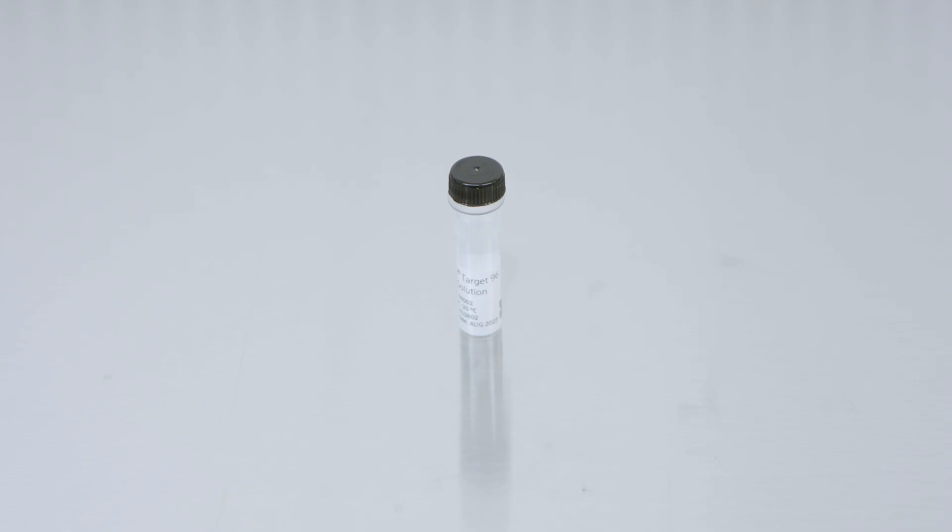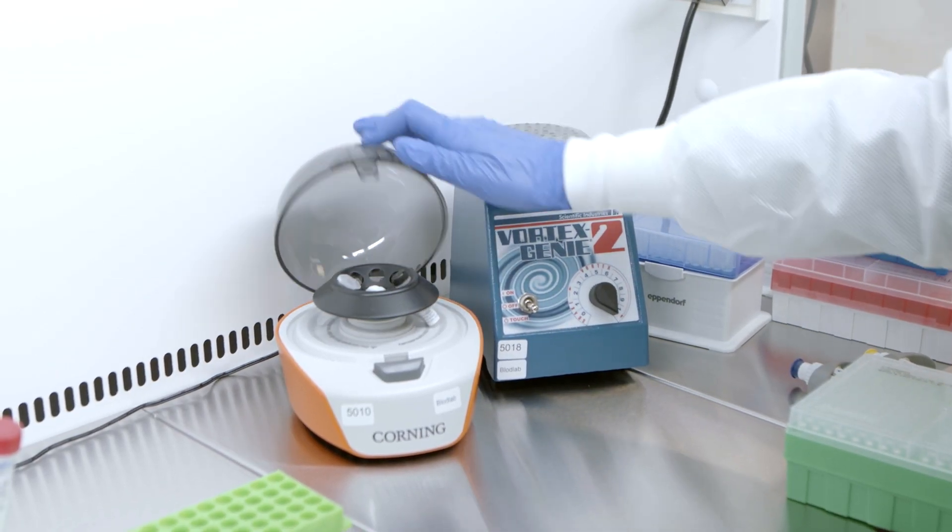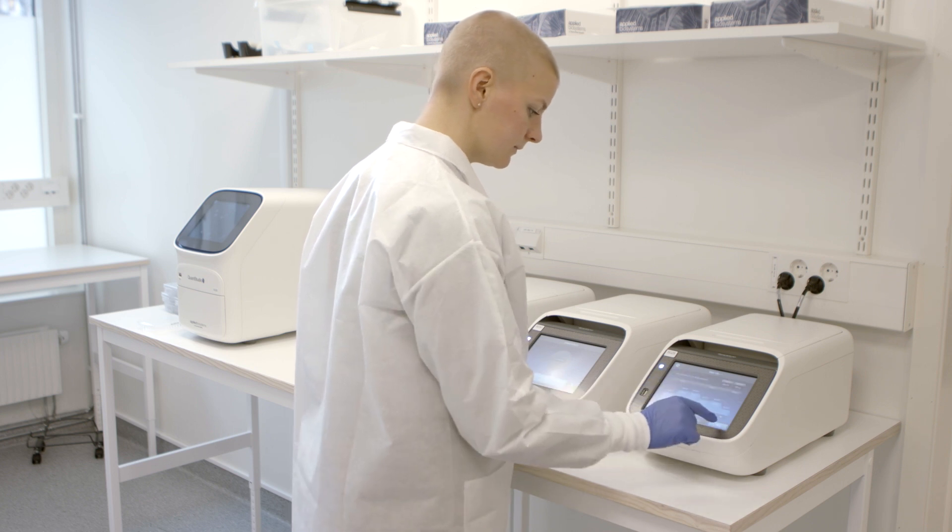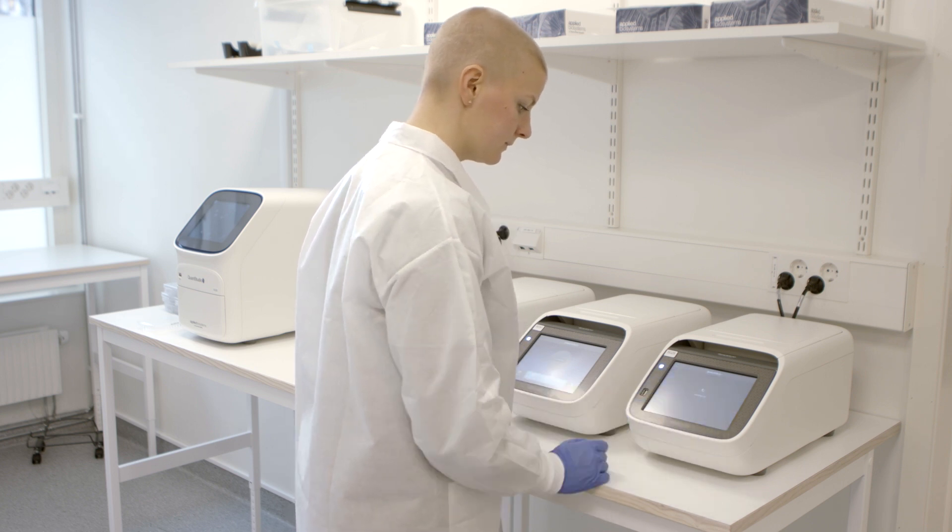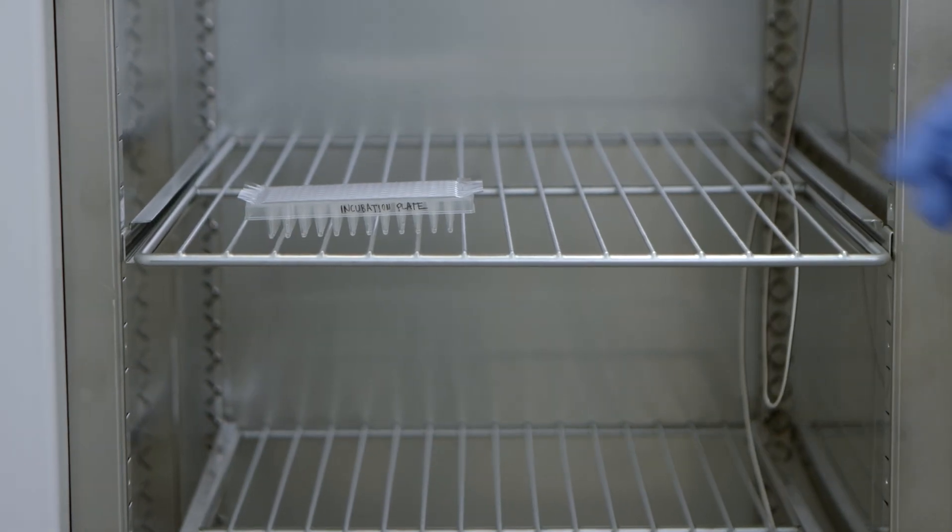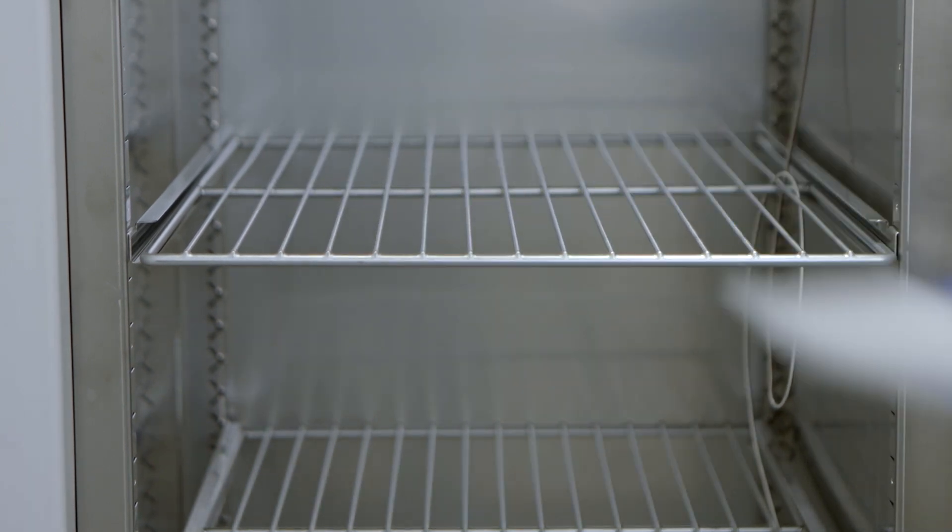Allow the PEA solution to reach room temperature and vortex and spin down before proceeding. Preheat the PCR machine by starting the extension program on your thermocycler and pause it once it reaches 50 degrees Celsius. Remove the incubation plate from the fridge and allow it to reach room temperature.